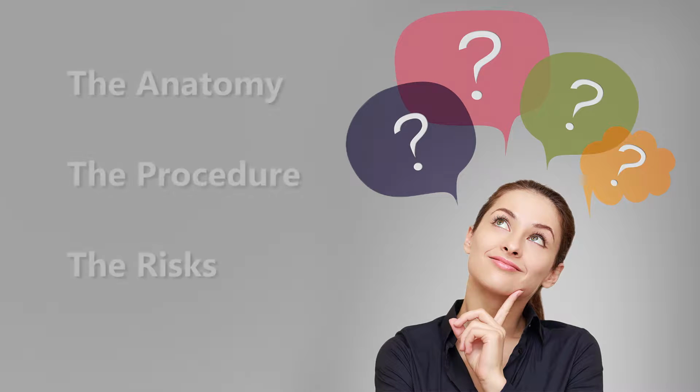During your consult, your surgeon will advise you on which is the most appropriate prosthesis for your age, lifestyle and bone quality. To better understand your procedure, we should take a few minutes to learn a little bit about your anatomy, the procedure, the risks and issues involved.